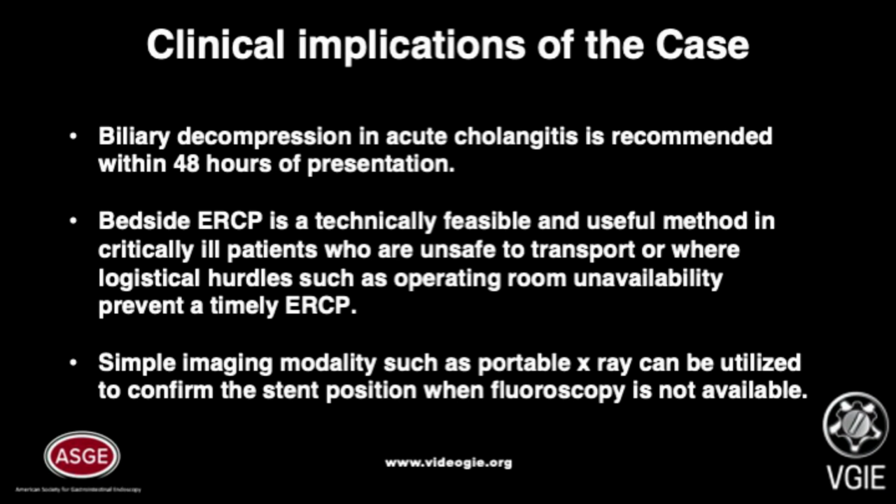Biliary decompression in acute cholangitis is recommended within 48 hours of presentation. Bedside ERCP is a technically feasible and useful method in critically ill patients who are unsafe to transport or where logistical hurdles such as operating room unavailability prevent a timely ERCP. A simple imaging modality such as portable X-ray can be utilized to confirm the stent position when fluoroscopy is not available.